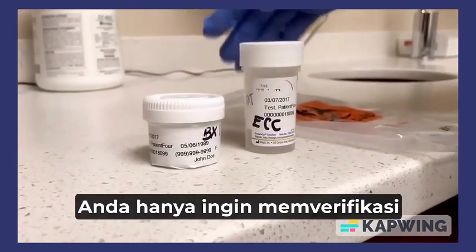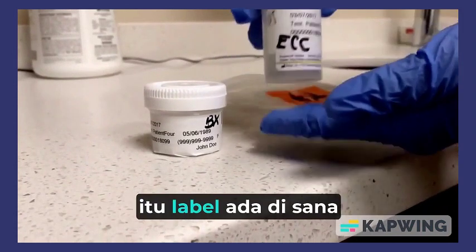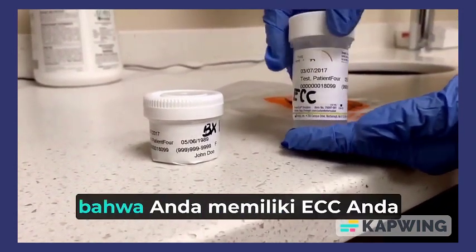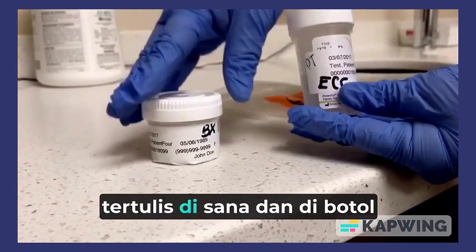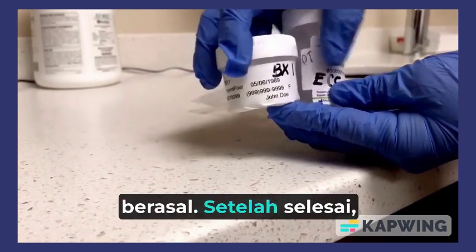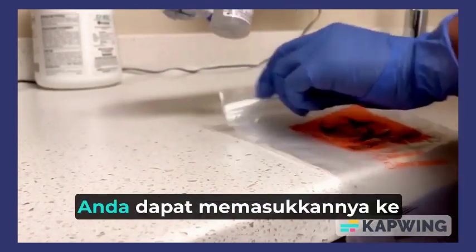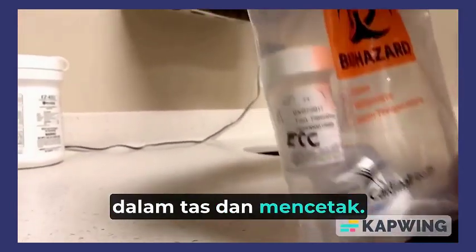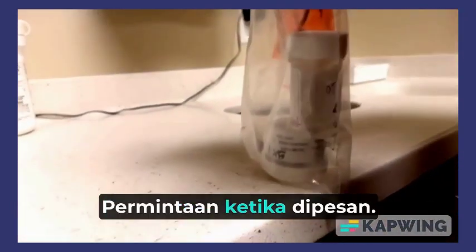After the procedure has been completed, you just want to verify that the label is on there and again initialed, and you want to make sure that you have your ECC written on there and on the second vial where that biopsy came from. When that has been completed, you can then place it into the bag and print off the requisition when it is ordered.